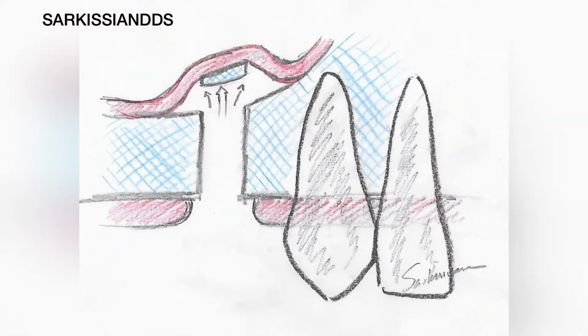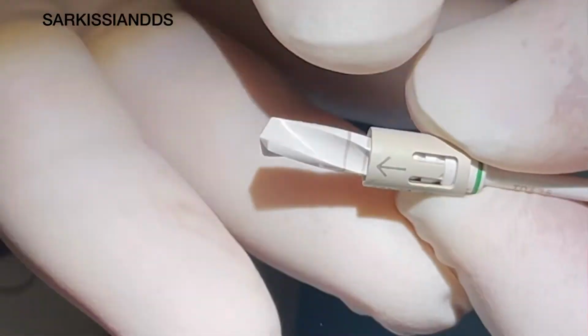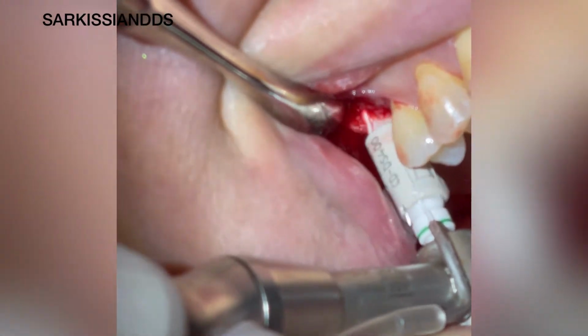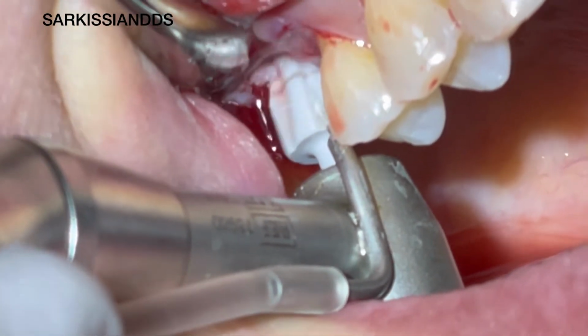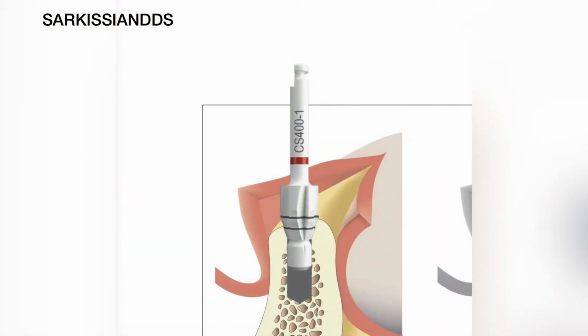Once the bone plug is fractured, you feel the advancement of the punch and of course you slow down. After the bone plug is pushed up, I use the final diameter burr to match the implant size. Because we are using the tissue level implant, which has a wider tulip, I always like using the countersink drill for it, but in this case, since we are in maxillary bone, not to its full depth.